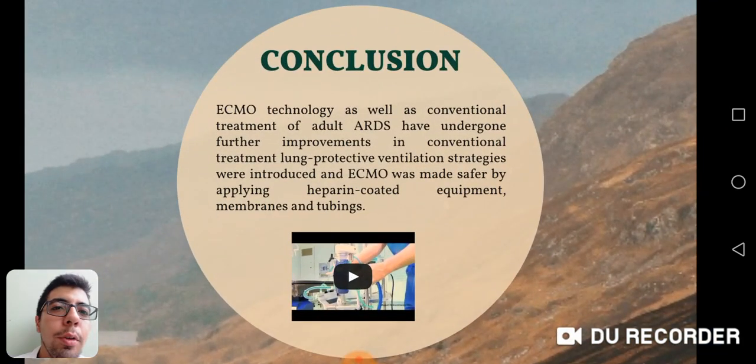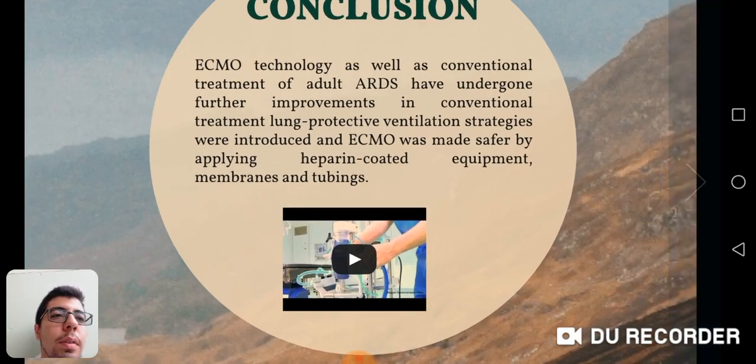Conclusion: ECMO technology, as well as conventional treatment of adult ARDS, have undergone further improvements. Lung protective ventilation strategies were introduced and ECMO was made safer by applying heparin-coated equipment, membranes and tubings.